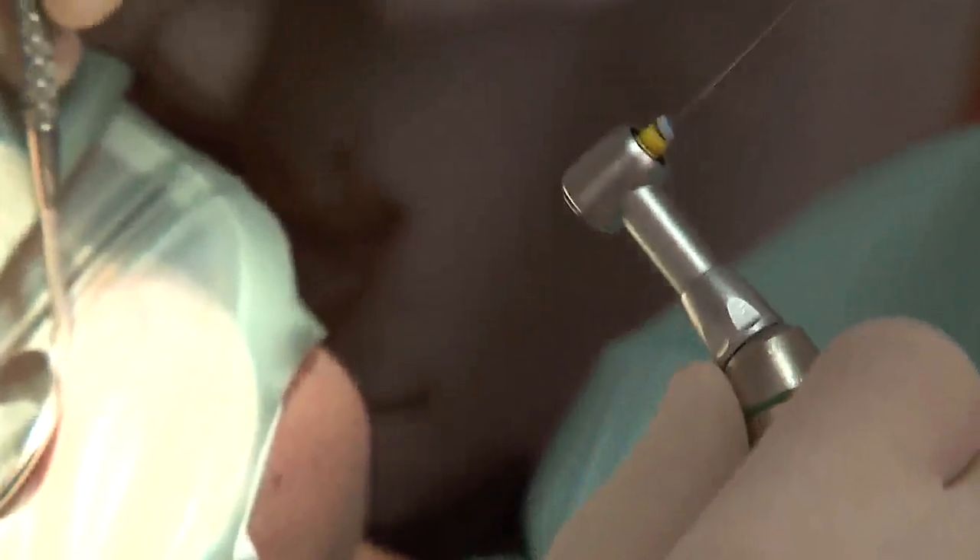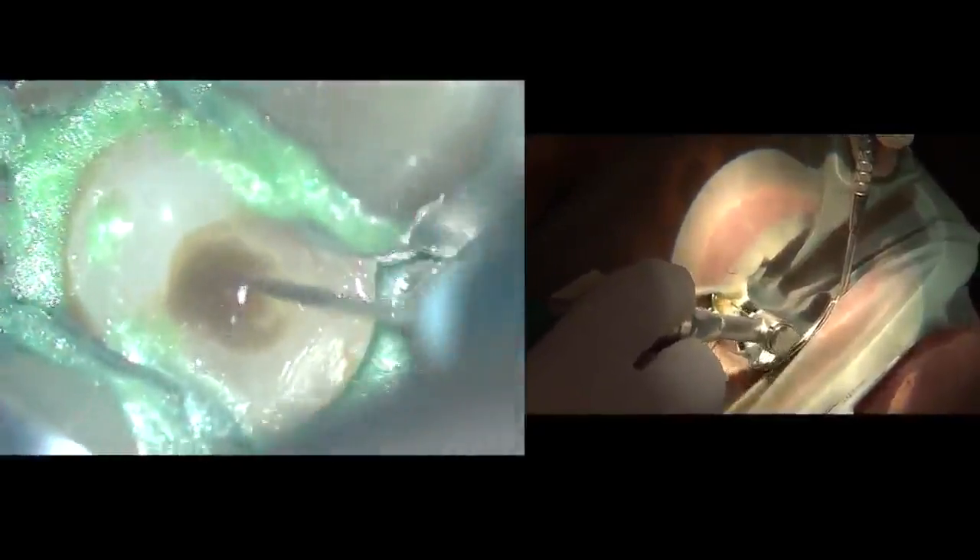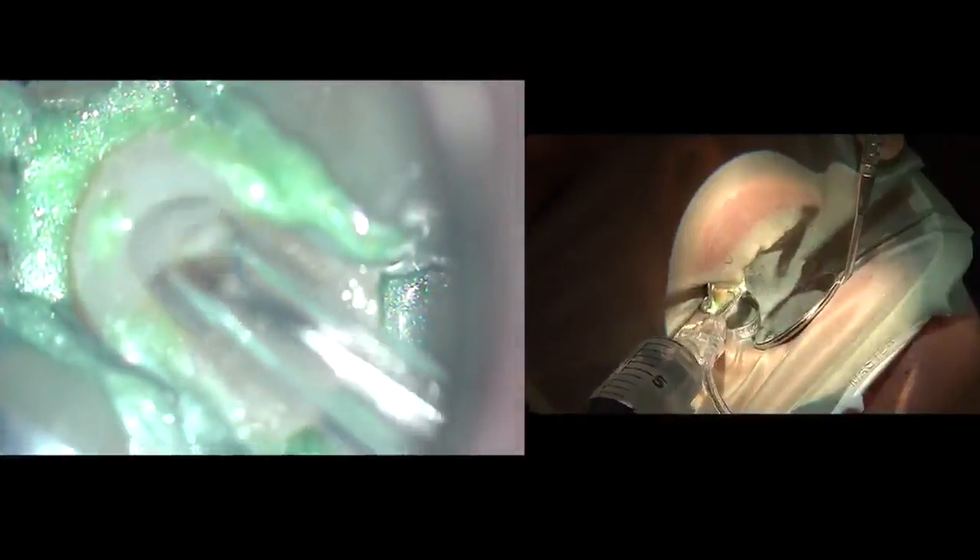The M4 handpiece is used in a crown-down motion with stainless steel files. We start with size 20 to create a glide path — 10 to 15 seconds per canal in a brushing movement. We must not force the file in; just leave it where it goes. INDOVAC is then used to flush all the debris out.